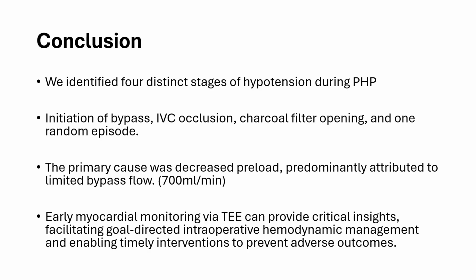So early cardiac monitoring via TEE can provide critical insights and can facilitate goal-directed hemodynamic management and enable timely intervention to prevent adverse outcomes. And I think this is also a very good tool to titrate the vasopressor use, to cut down on the use, and maybe limit it to 1 or 2 instead of 3 or 4.